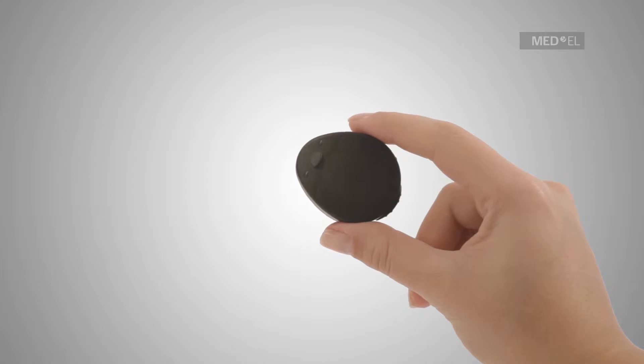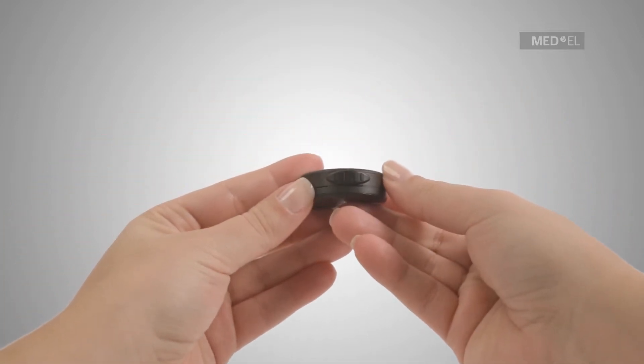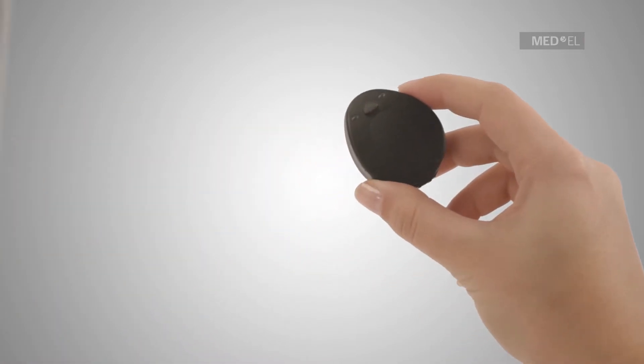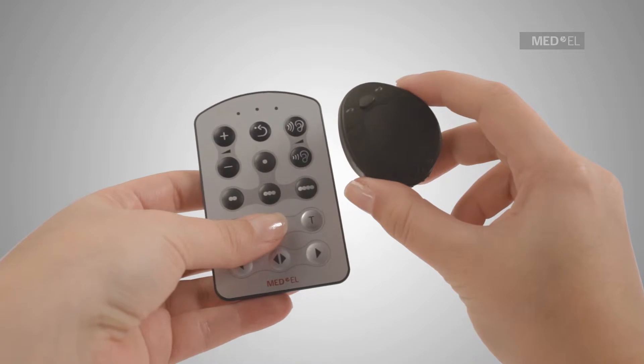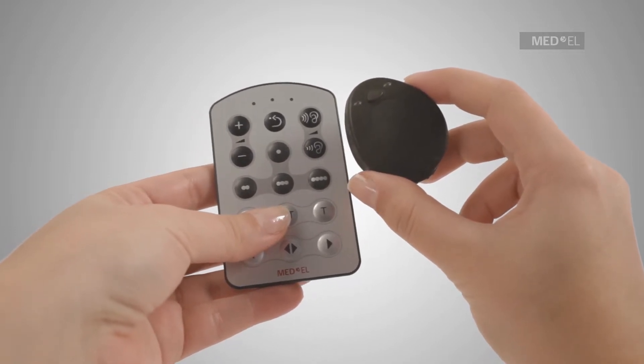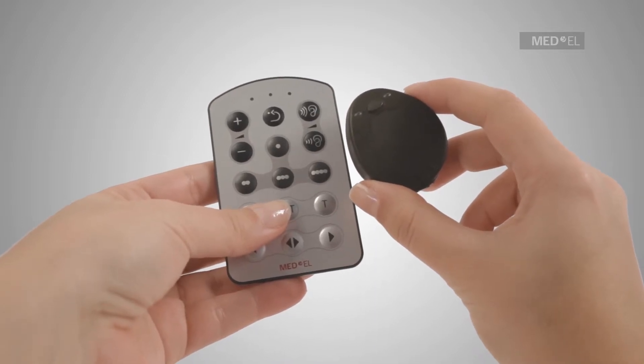The Rondo has only one switch located on the control unit. All other functions of the Rondo can be accessed via the FineTuner remote control. Like a remote for your television, the FineTuner can help you to make adjustments without the need to remove the audio processor from your ear.